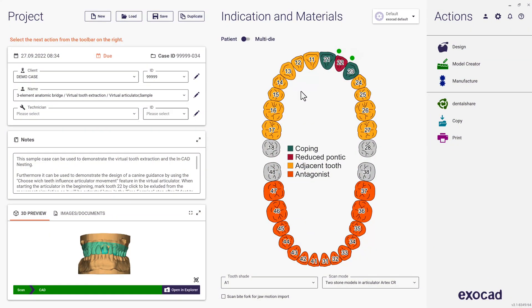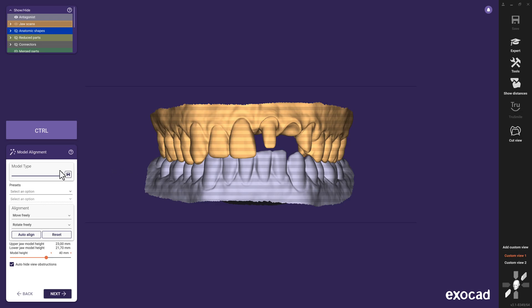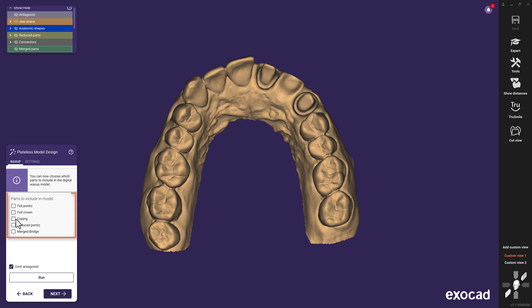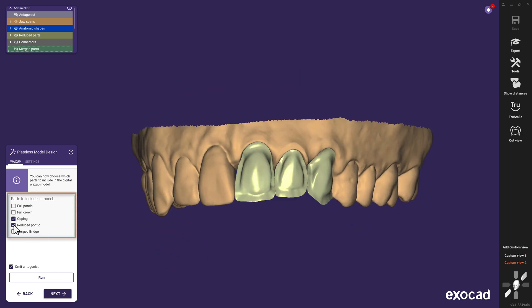Let me show you this on an already designed reduced bridge by starting the case directly from the DentalDB, but this time with a click on model creator — the second option to start the workflow. Here you can see that every stage of your design is available to you to be combined with a model, so you can freely choose the anatomical parts that have been reduced during the workflow as well as the freeform final bridge.